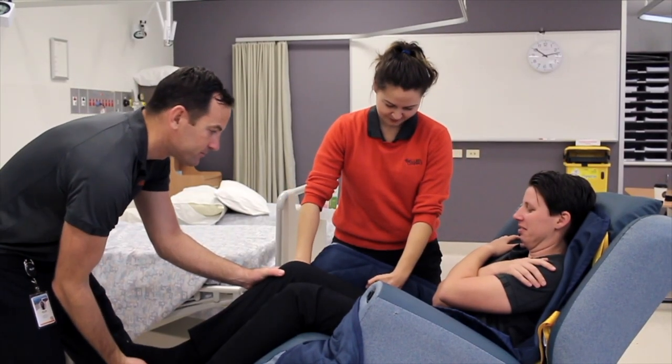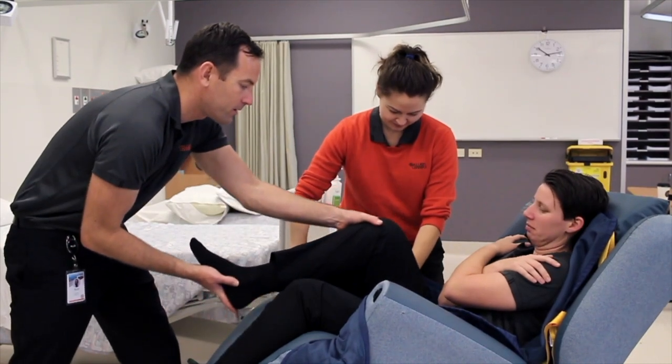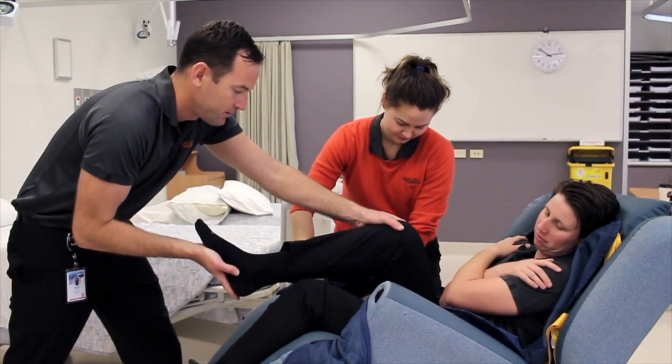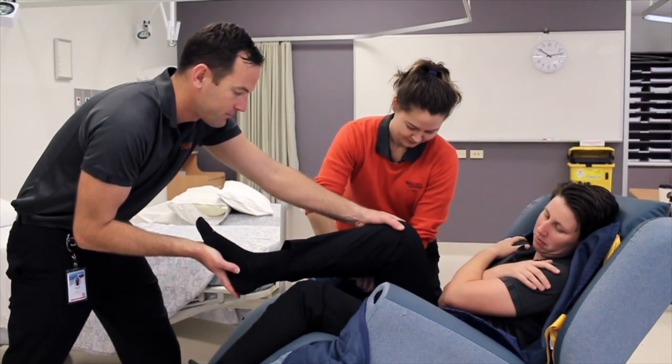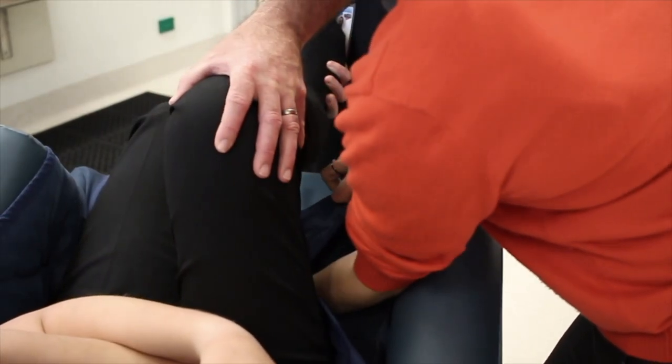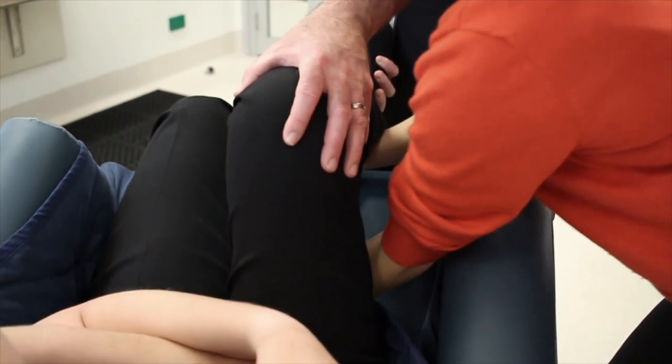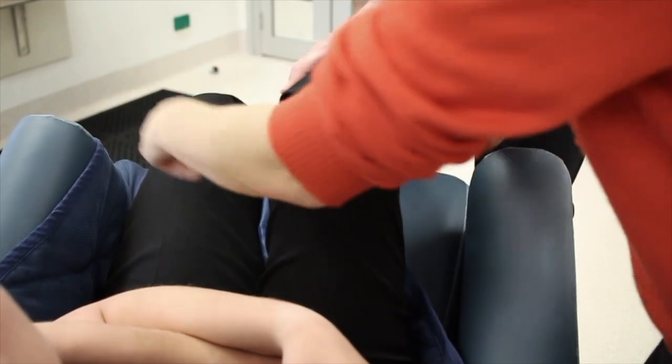The therapist will assist the hip into flexion and adduction while the other therapist will position the leg strap underneath the thigh. Making sure that it's nice and smooth so as to take any creases or risk of skin tears away from the resident or consumer.